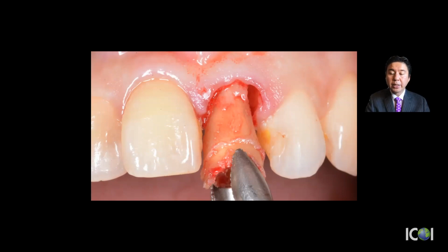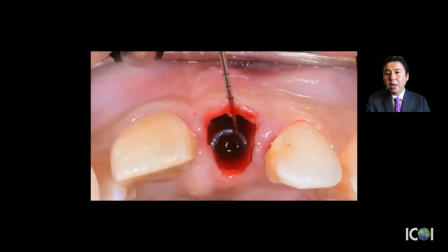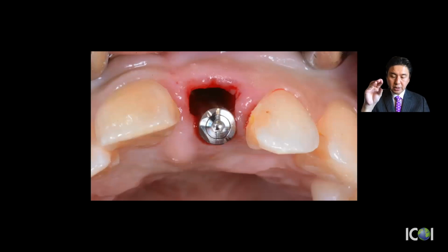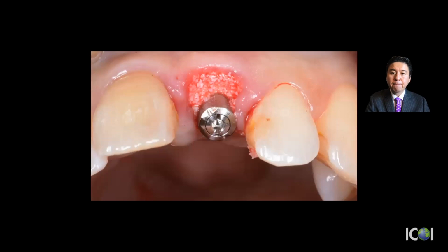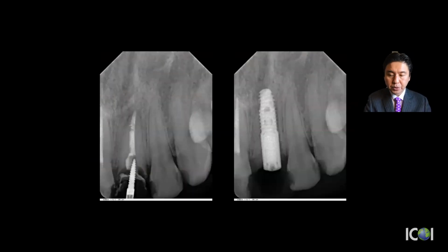So this is hopeless. I took the tooth out and then checked the bone on the buccal side and then placed the implant palatally. Okay, between the buccal bone and the implant is about a 3 to 4 millimeter gap, the same concept. I put the straight healing abutment. Okay, this is also the coded healing abutment. You just need to scan the slit and the slots. Okay, I place the bone graft towards the soft tissue, always going not only to the bone area, but towards the soft tissue, and then with flowable composite, make a shell around the surgical site.